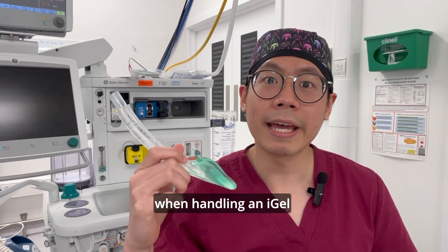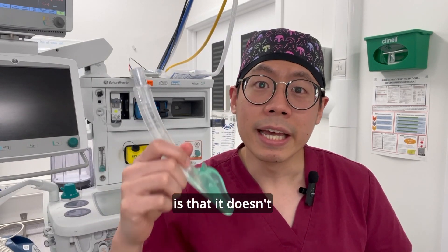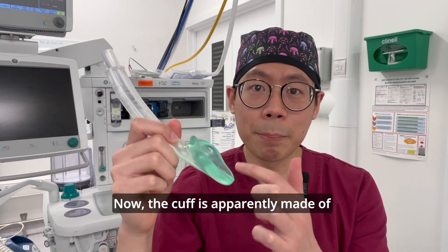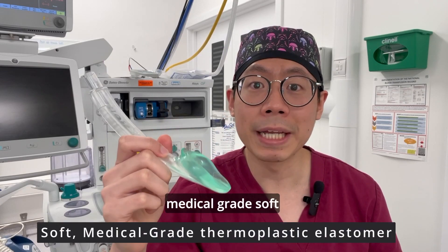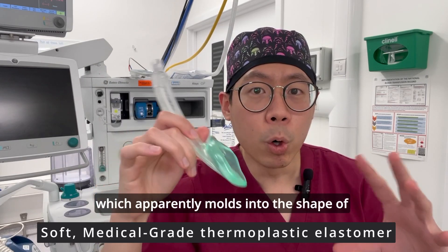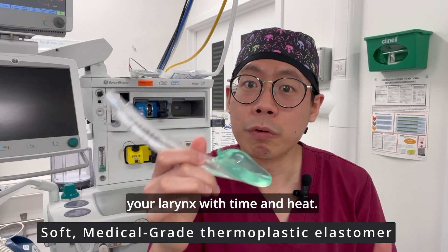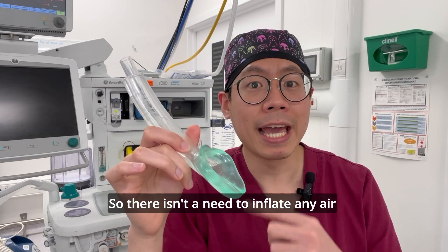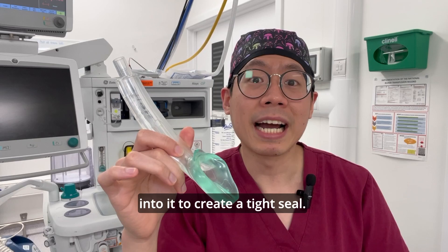The first thing you'll notice when handling an i-gel is that it doesn't have an inflatable cuff. The cuff is apparently made of medical-grade soft thermoplastic material which molds into the shape of your larynx with time and heat, so there isn't a need to inflate any air into it to create a tight seal.